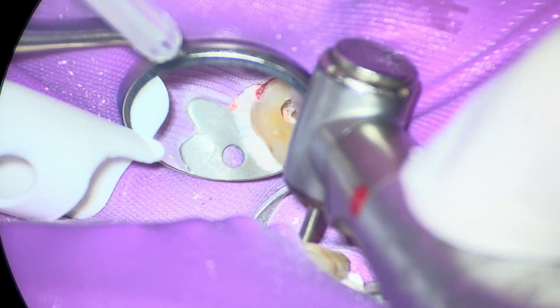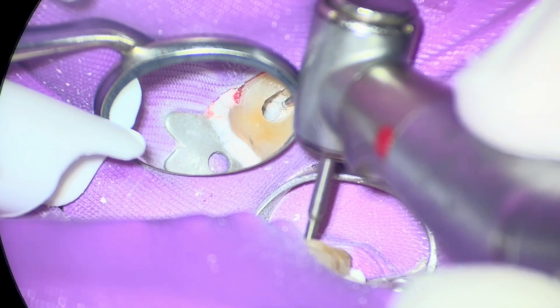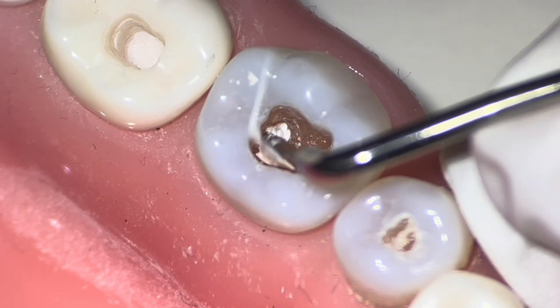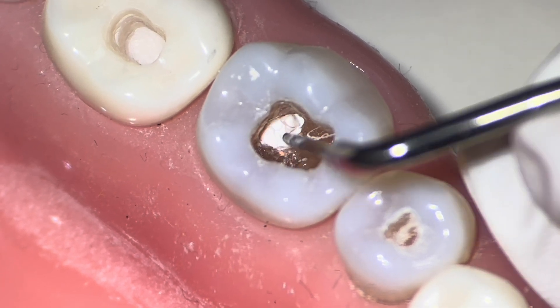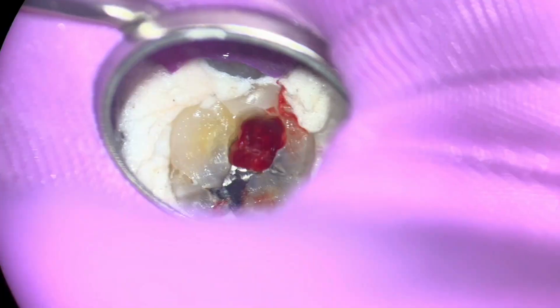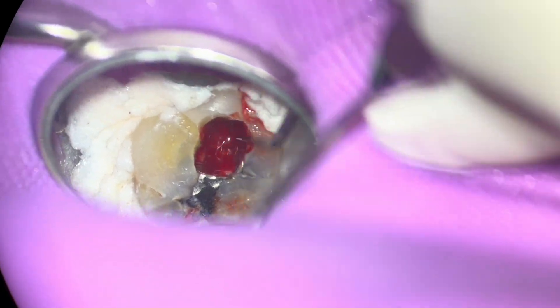One of the things you can do — say you've already done your access and you're going to refine it — you can take some Teflon, place it into the orifices, and that'll block the canals while you're refining your access. Do you need to do that at the beginning of your root canal? Probably not. This is mostly useful after you've cleaned and shaped and are just refining the access.